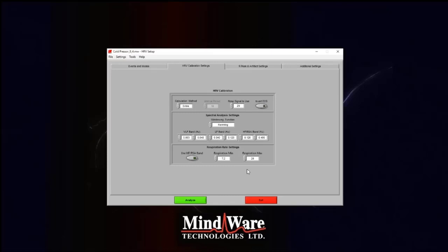Okay, and then let's see here. This next question is, can you repeat the second choice if you're not using RSA? I think I've done it a couple of times, but RMSSD would be that second option if you're not going to use that frequency statistic.